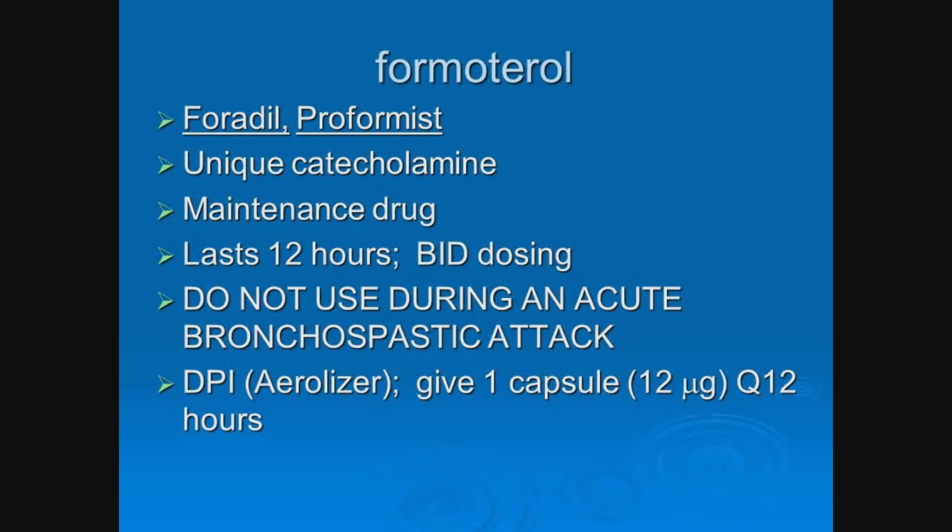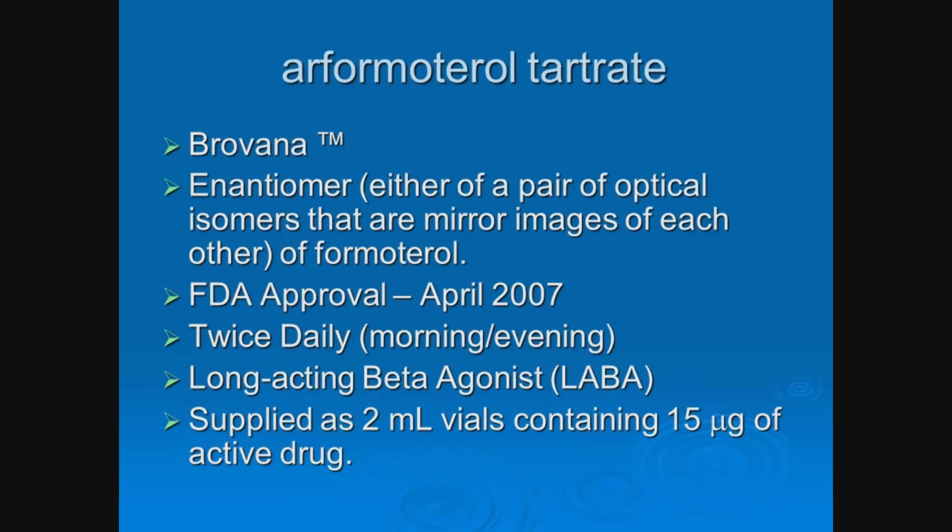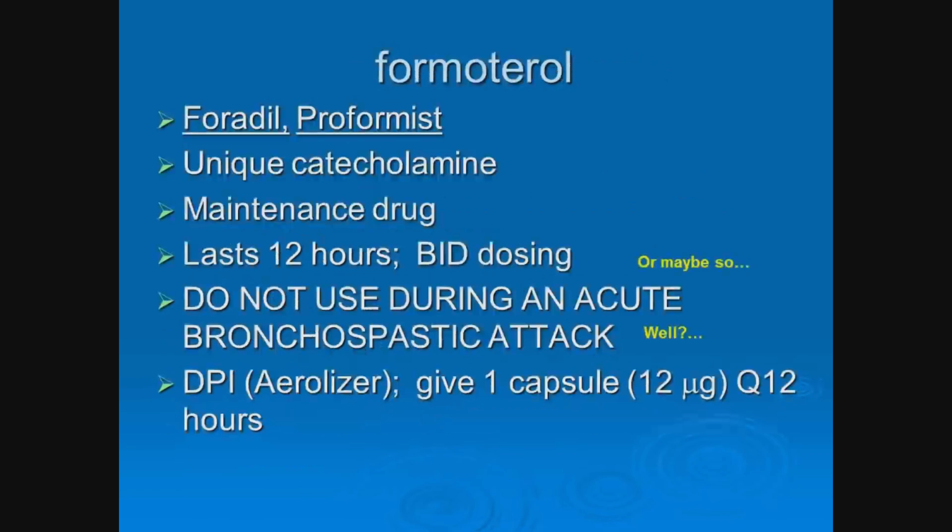Supplied as a DPI. It's the Aerolizer. It's one that has a capsule. You've got to take it out of its blister pack and put it into the device. So formoterol is a drug that is utilized a lot as a combination drug with inhaled corticosteroid, as we will see.